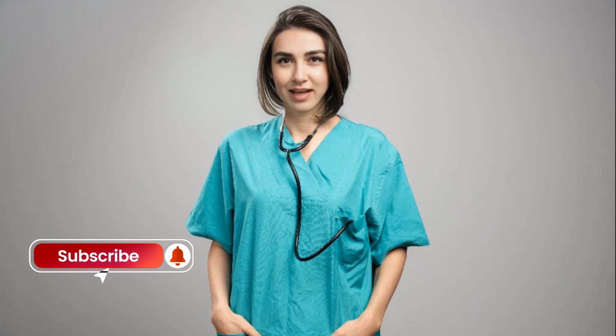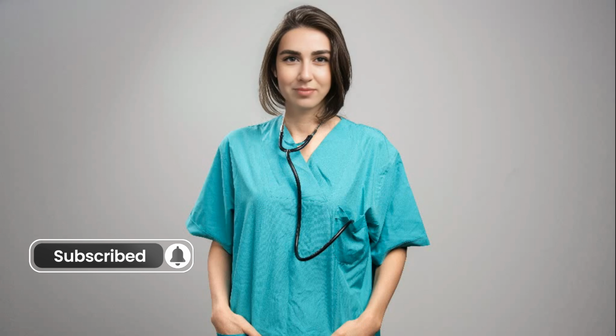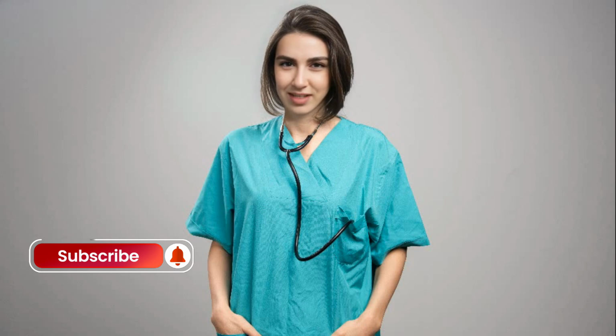Emergency surgery due to complications during angioplasty is rare, especially with advances in equipment and techniques. However, in about 1 to 2% of angioplasty procedures, complications may arise that necessitate urgent intervention, such as emergency coronary artery bypass grafting (CABG). The exact rate varies depending on factors like patient health, the complexity of the blockages, and the expertise of the medical team. Reasons for emergency surgery during angioplasty. Emergency surgery may be needed if complications develop that can't be managed through catheter techniques alone. Key reasons include 1. Artery rupture or dissection.